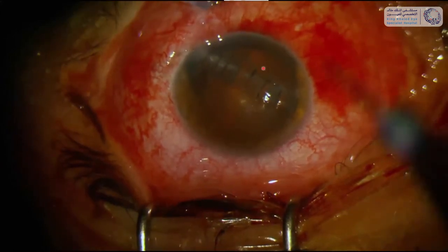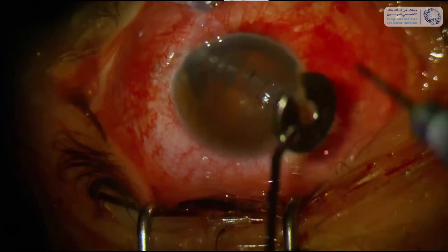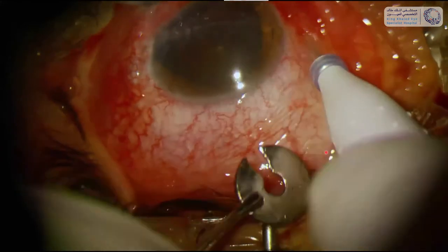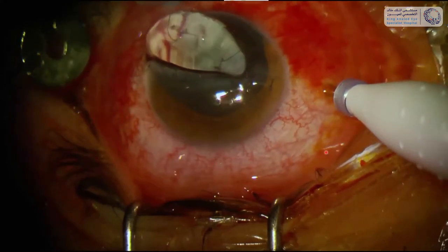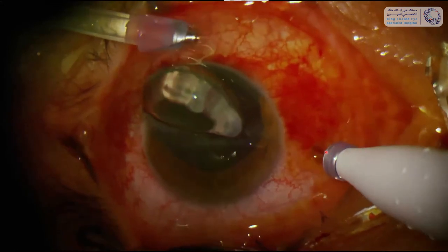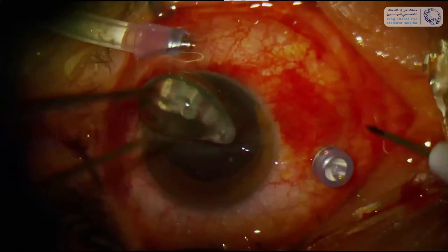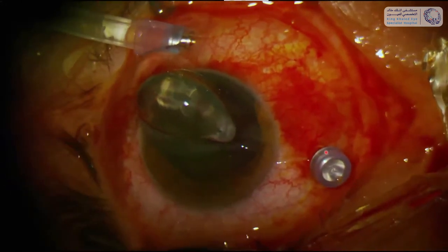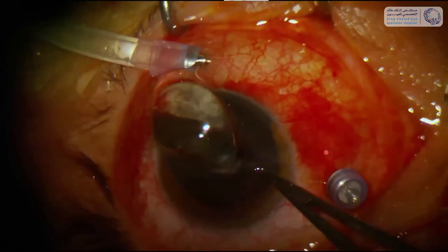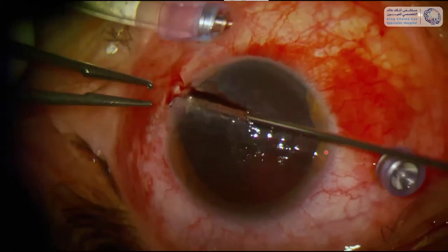The cornea was already sutured and something very unpleasant happened at the beginning of the surgery. I had already installed the infusion, but when I installed the first instrument cannula this happened — one of those unfortunate moments. I first thought it was vitreous prolapse, but you will see in a moment that actually it's his lens that came out. When I touched this prolapsed tissue with the instrument, it was clear this was not vitreous — this is a clear lens in a 20-year-old patient.